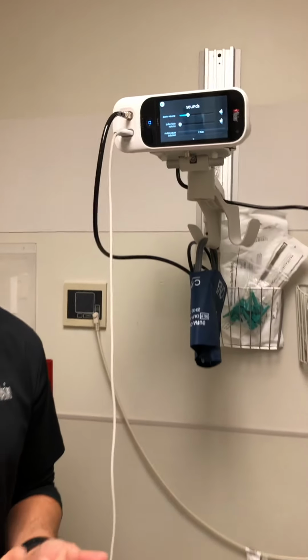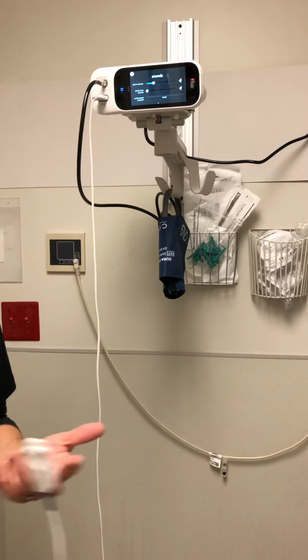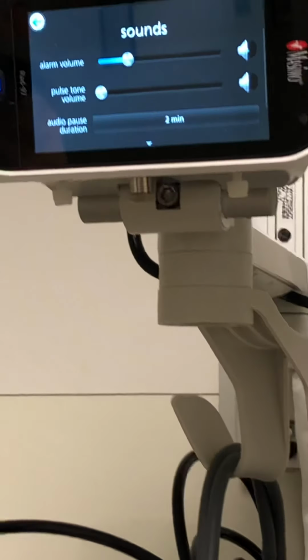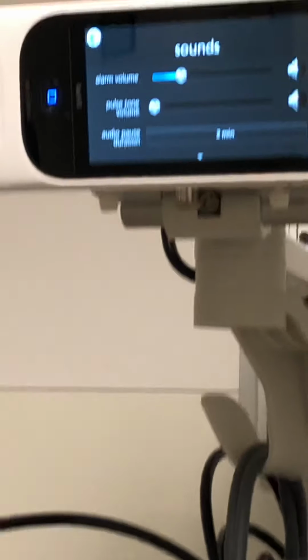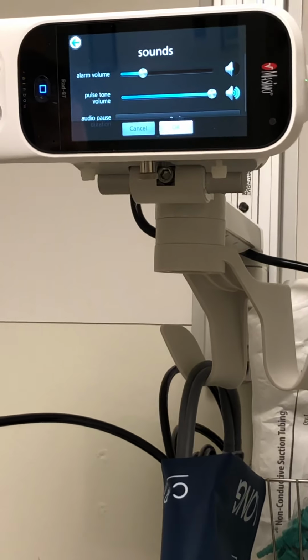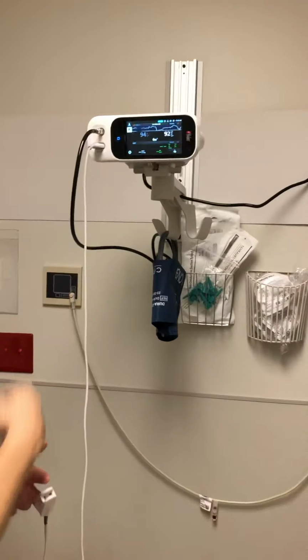They are on the quieter side. If you guys find that they're not loud enough, please let us know. We'll come back in and make the adjustment, or you can make the adjustment on a patient by patient basis, okay? Additionally, there are pulse tones available on the monitors. We typically default these to off because they're just unnecessary and annoying. However, if you guys ever have a code blue, a rapid response, anesthesia were present, sometimes they like having the pulse tones going in the background just so they can hear that the patient's doing okay. But like I said, they're defaulted to off, okay? Going back to the home screen again.